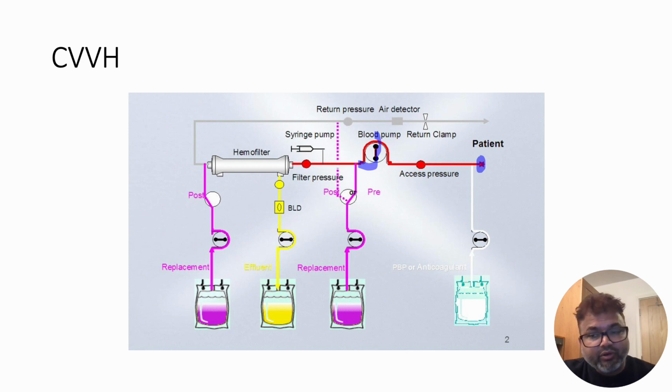So there is a part of ultrafiltration. The pump is there, blood is being forced there. It's maintaining flow, along with that it's pressurizing blood inside the filter. So you put some fluid before the filter, and here you just assume that we are going to give pre-filter fluid. So this fluid goes to the filter, and then the mechanism of solvent drag works and removes the solute.